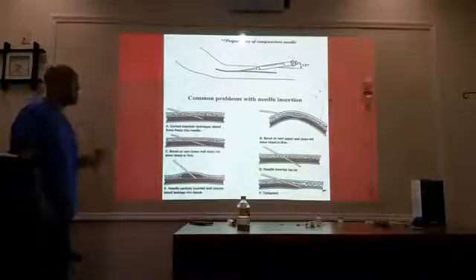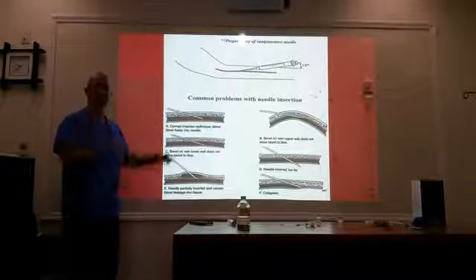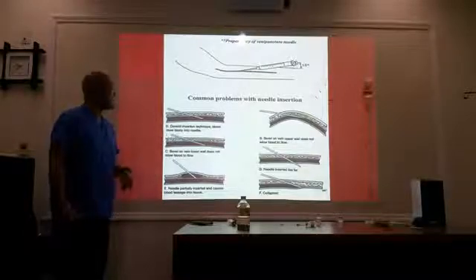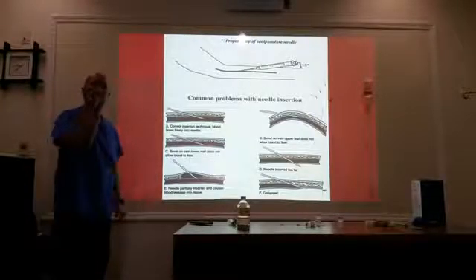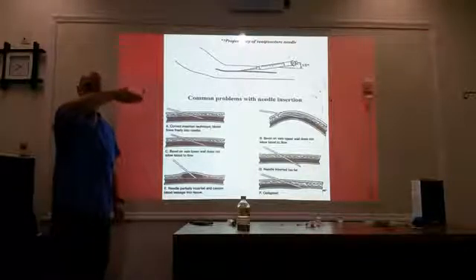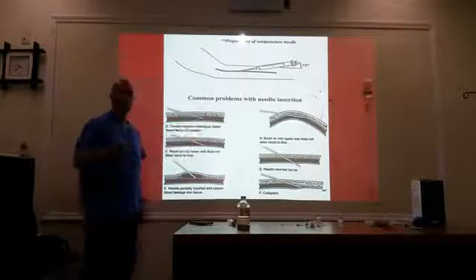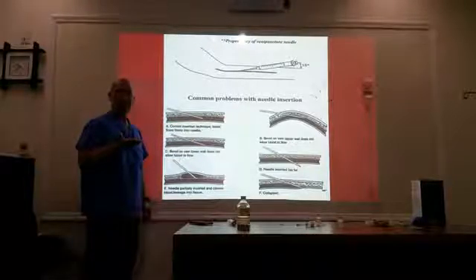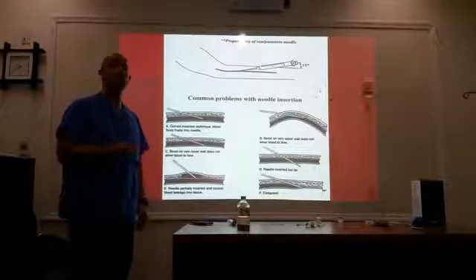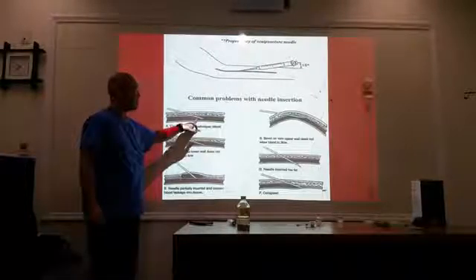Some common problems with needle insertion. Letter A is the correct insertion technique. Remember the bevel tip of the needle. You want that bevel edge or tip to face upwards. That's common practice. It's just a lot easier to also see the needle going into the skin as you penetrate it. So bevel up. This is the correct way.